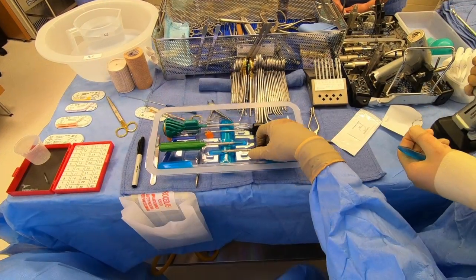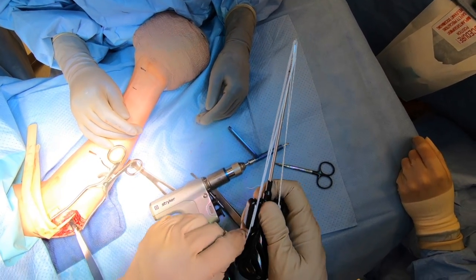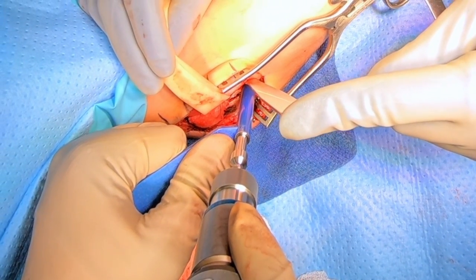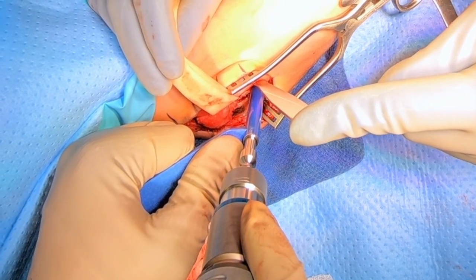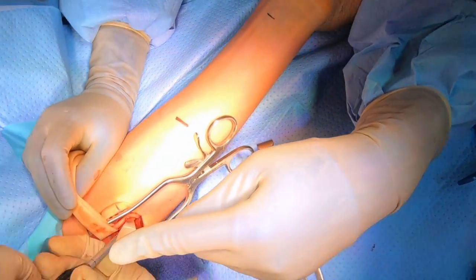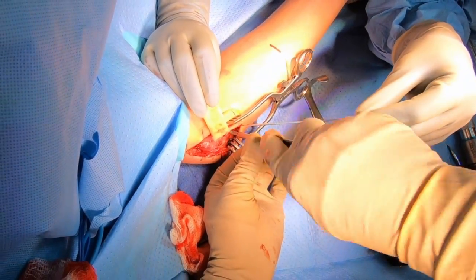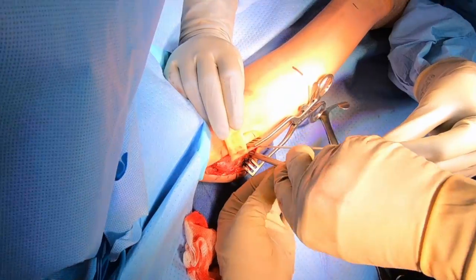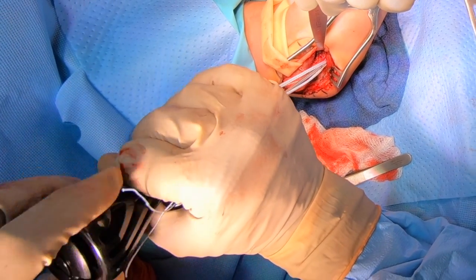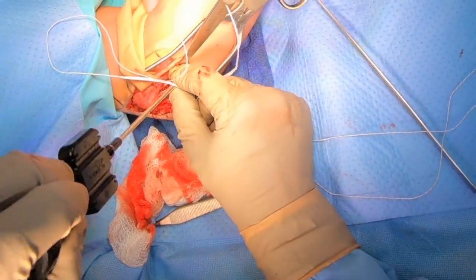We're going to use a kit for this repair. It involves two anchors. Here's me loading up the first anchor that goes into the lower arm bone, the forearm bone. We'll drill into the bone there carefully, making sure to protect the nerve, and making sure that we place it exactly where the ligament is supposed to attach. We'll then cut threads into the bone for the anchor using something called a tap. Once that's removed, we'll insert our anchor — which has sutures on it. You can see the anchor being inserted and then these sutures will be used to pull that ligament back down to the bone where it's supposed to be attached.